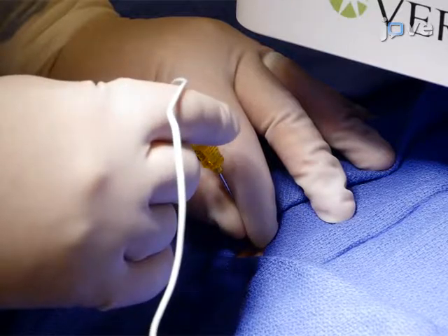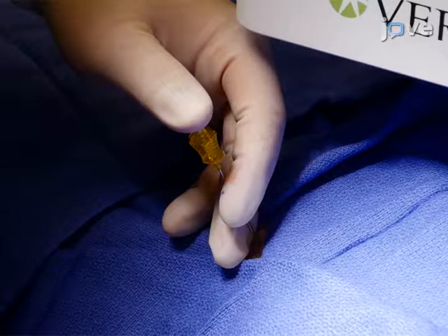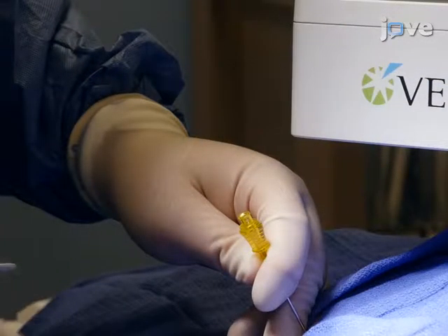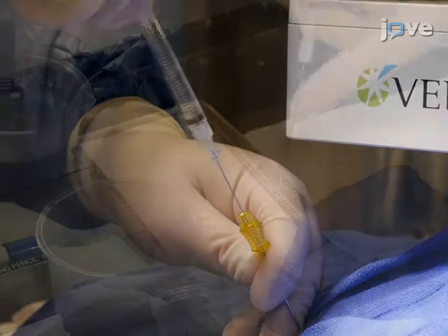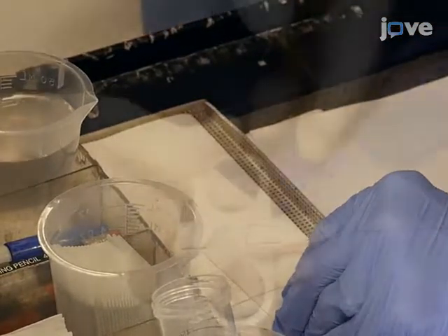Remove the guidance needle stylet from the needle, taking extreme care to avoid moving the needle. Then use the finger to cover the hub of the needle. Insert the 20-gauge FNA needle through the 19-gauge needle. Sample the lesion and provide the specimen to the cytotechnologist for rapid on-site evaluation.